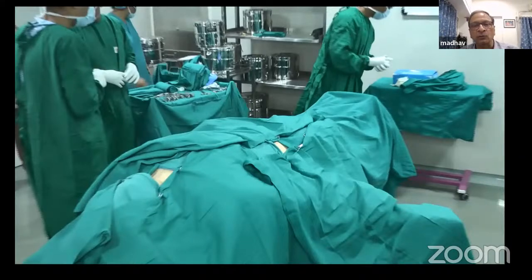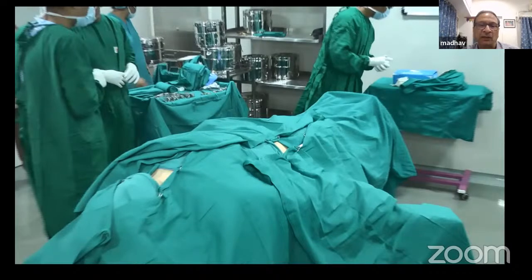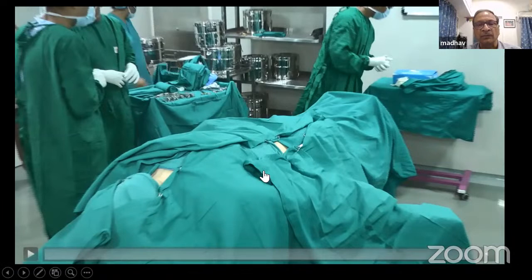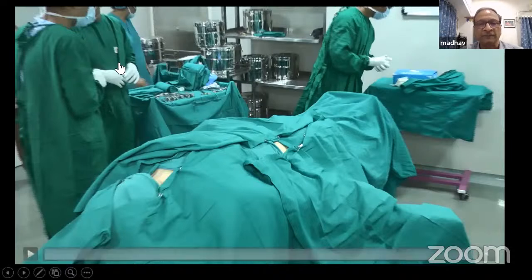It's always better to use adhesive surgery drapes, like IOBAN or Surgery drape, which are adhesive, so that they keep the sheets in place, and they would keep the sheets secure in place and not allow them to slip and fall or move away from the operating field. So that was about anterior cervical spine and iliac crest bone graft.